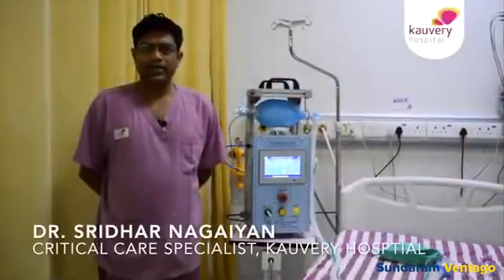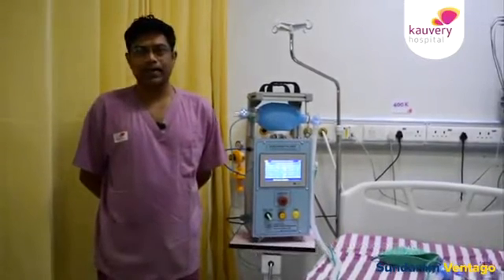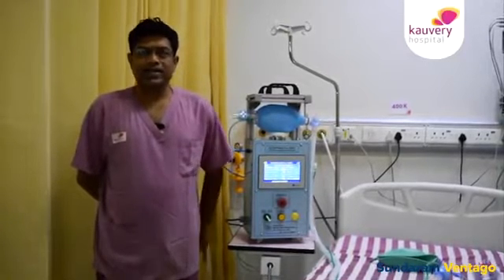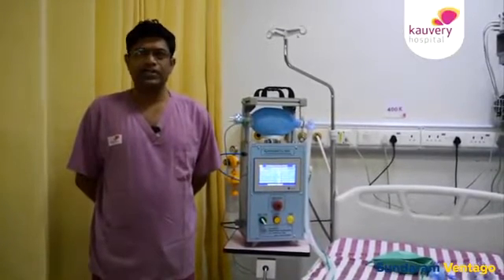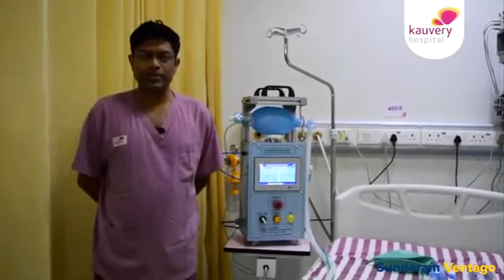Those who deteriorate, as we know the coronavirus afflicts the lungs, whose lung condition becomes so bad that they need ventilation, then we will put them on the ventilators. But ventilators are a limited resource. There are only a certain number of them that can be used. When our ability to ventilate people with the usual ventilators is overwhelmed, then a ventilator like this will be a good option to support these patients until their lungs make a good recovery.